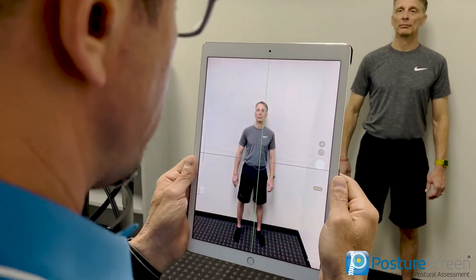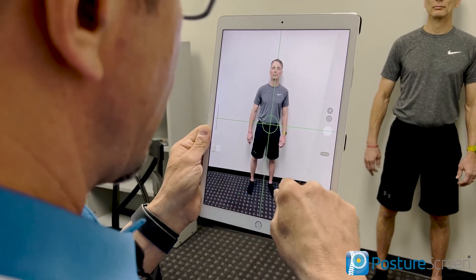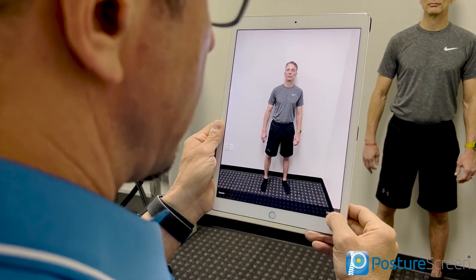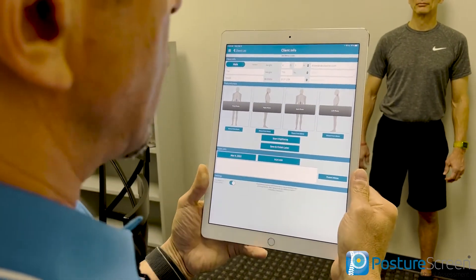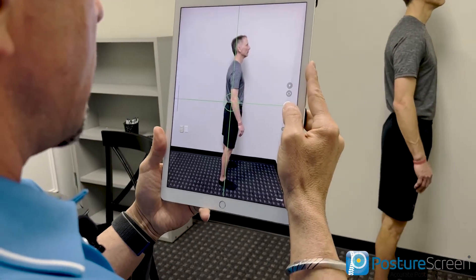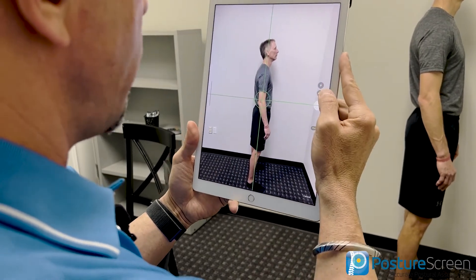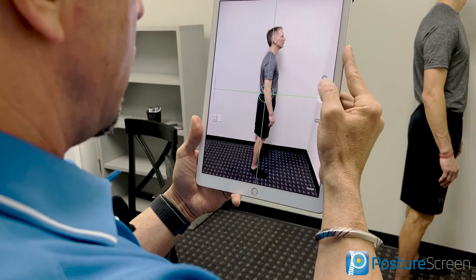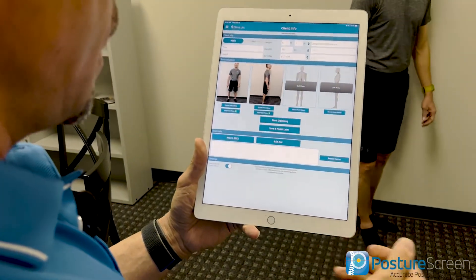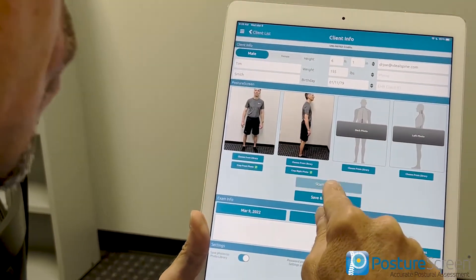You're going to get a heads-up display on older devices that you want to make sure is centered on the person. Also pay attention to the backdrop — you want to make sure that's fairly level. Go ahead and snap the picture, then hit Use Photo. On older devices, that's a little bit slower. Now we're going to ask the patient to slowly turn to the side, do the same thing again, making sure it's green and the background is level. Then go ahead and click and hit Use Photo. Notice it's automatically cropped down the image — that's new and exciting, something we had to do manually before. Then we hit Start Digitization.